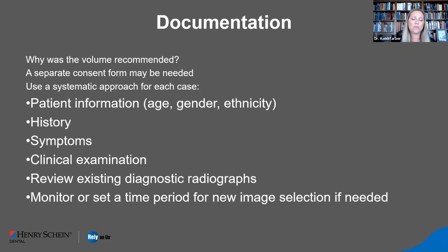A separate consent form may be needed, and this is a recommendation, but when these things go into a court of law, many times the consent form is what they go after, and they'll say the patient wasn't fully informed, even though they might have signed two or three of them. Still smart to go ahead and have some sort of a consent form that's written up for your patient. You might want to talk about radiation dose, why they might need this, why this is important. You probably already have something like that in your office.